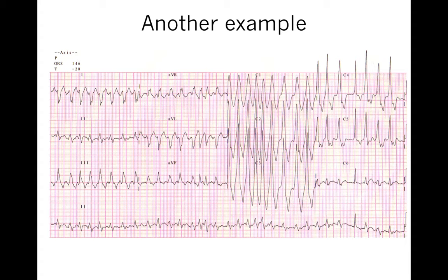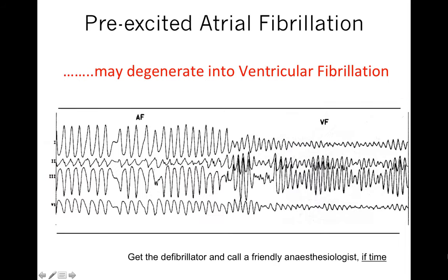Here's another example of pre-excited atrial fibrillation — a wide complex tachycardia that is irregularly irregular with all QRS complexes looking similar. Pre-excited atrial fibrillation is not benign and can degenerate into ventricular fibrillation and cause sudden death. The rate is so high it can cause ischemia within the heart. Hence, it is a medical emergency.